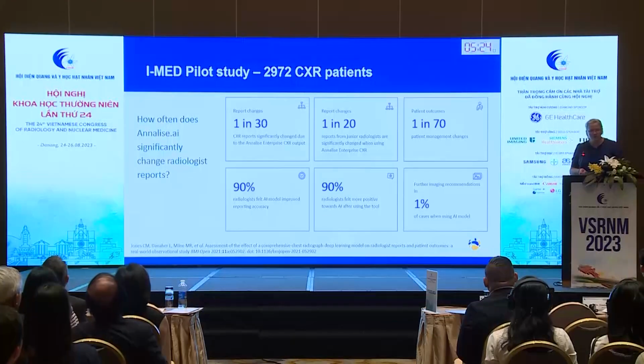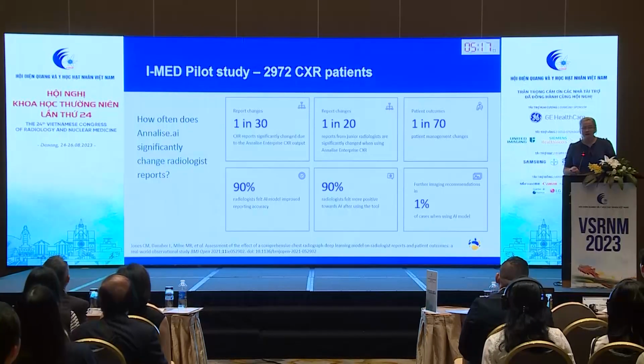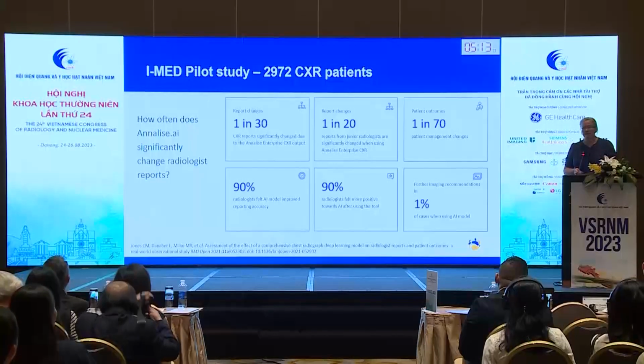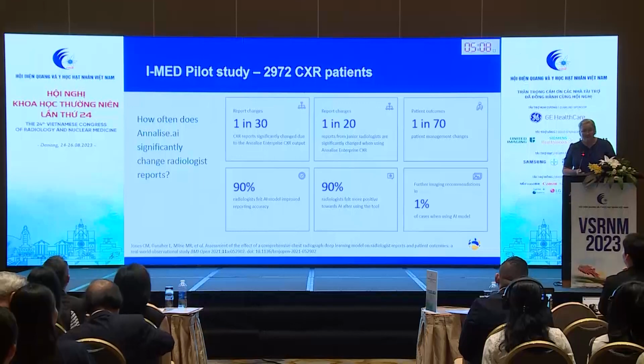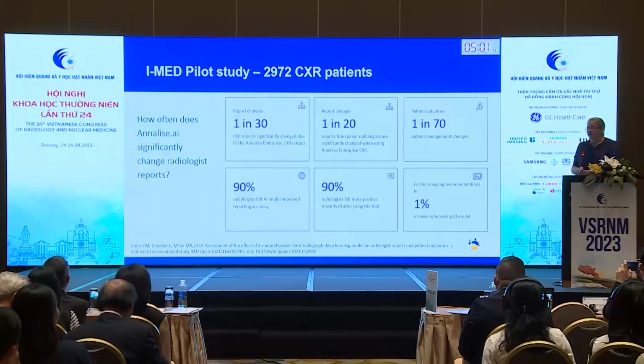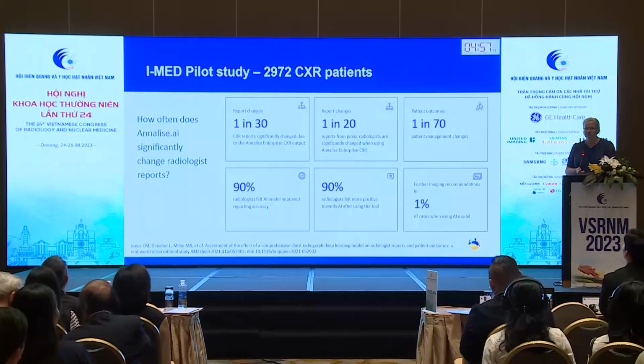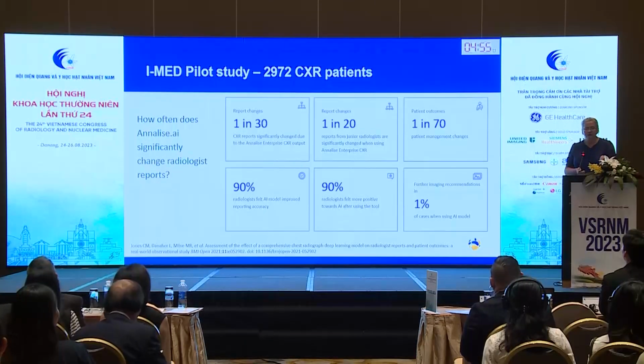That's 1 in 30 patients. When we looked at our more junior radiologists, less than 5 years, finishing training, that number was 5%, 1 in 20. The radiologists admitted it changed their report. That was huge. Then we asked them for every case, did this affect the patient management immediately? And they said 1 in 70, it did.